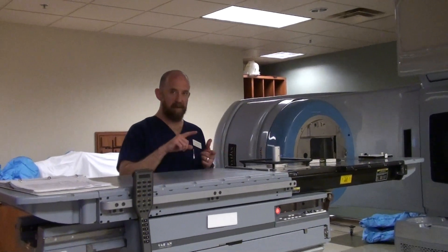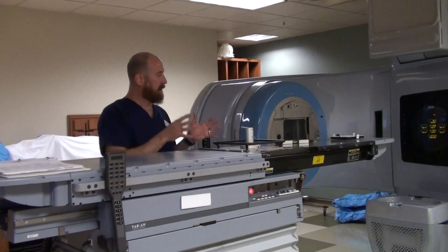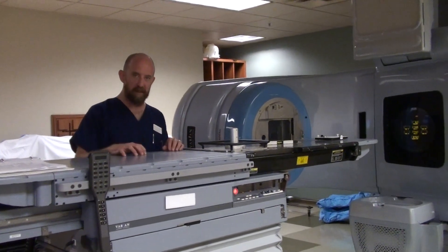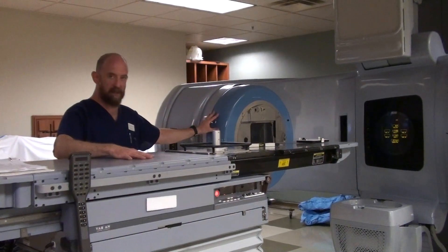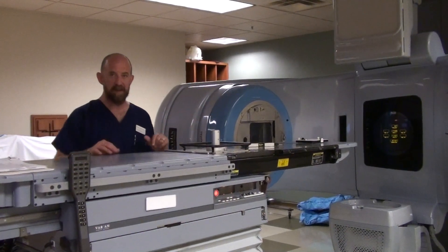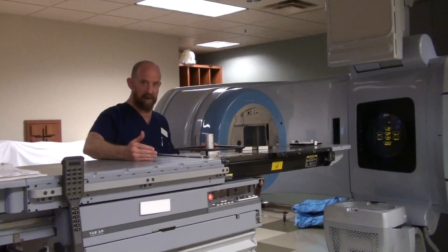After you've checked your field size, your collimator, your gantry, your lasers, all of that stuff, you're going to do output checks on the machine. That's going to vary from place to place, but basically you're going to run energy through the machine onto a device that will actually read the actual radiation that comes out. It's going to tell you whether the output is correct.